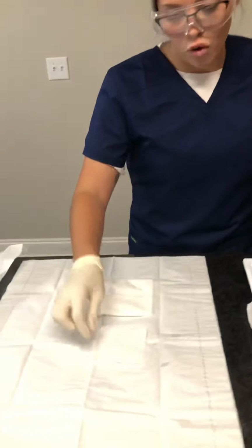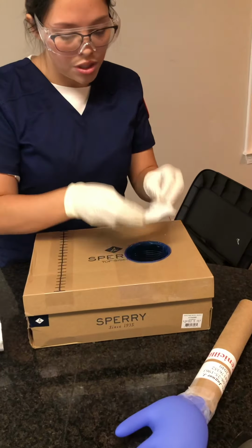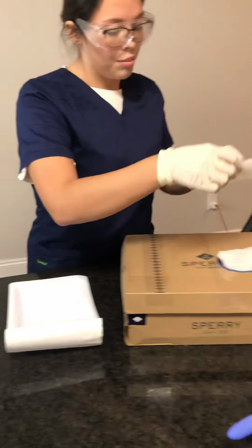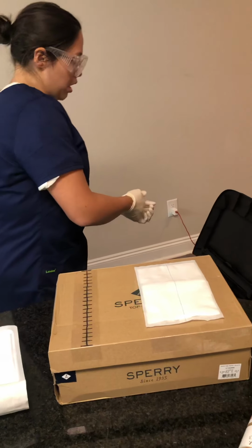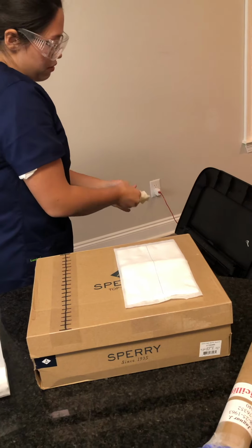I will then grab a 4x4 dry piece of gauze and place above the wound. And I'll then grab the ABD pad and place it above that. I will then remove my sterile gloves. Doing glove to glove, skin to skin.